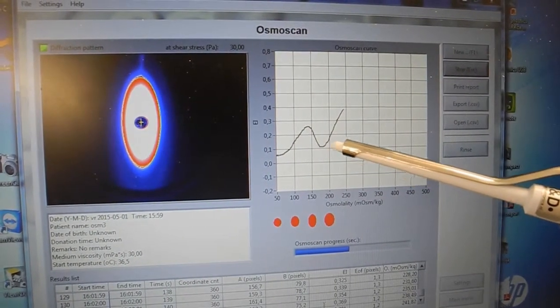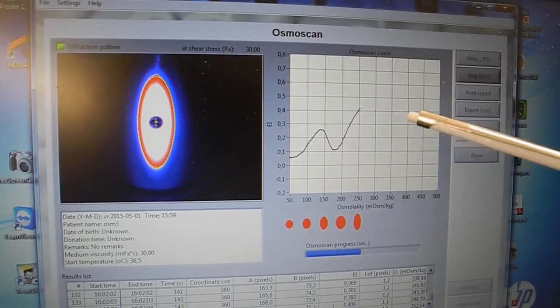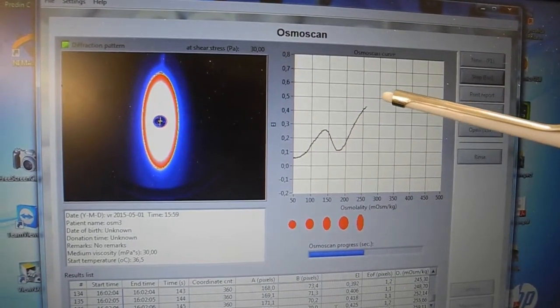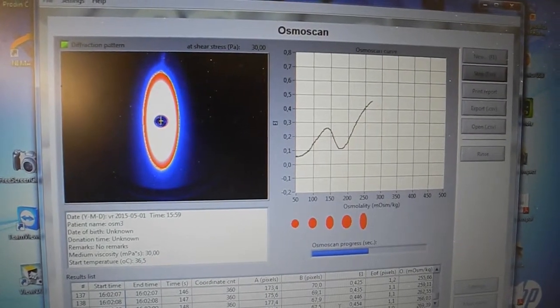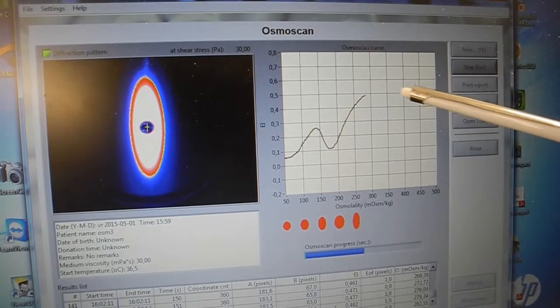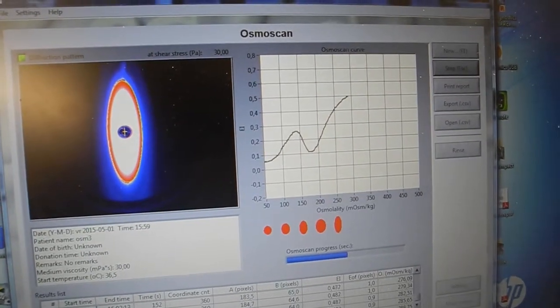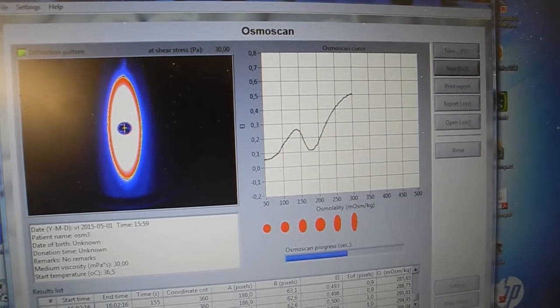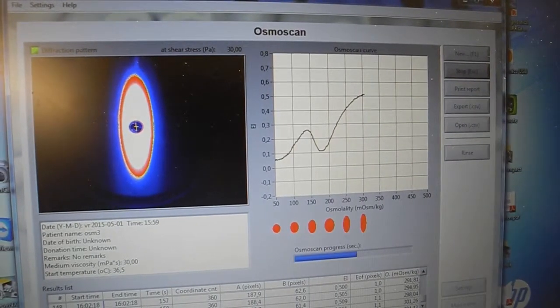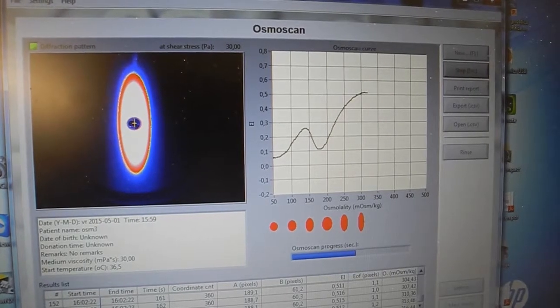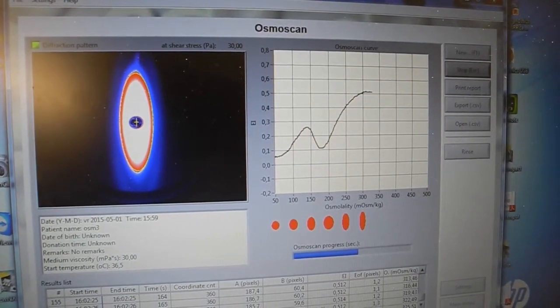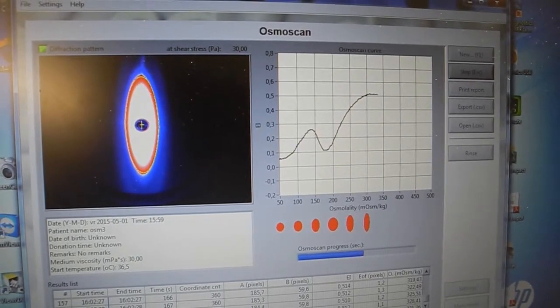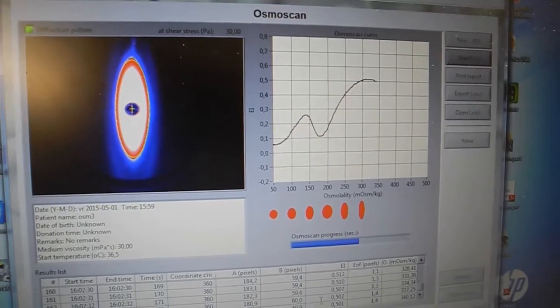They start getting more and more elastic as they approach the optimal osmolality for the cells, which should be around 300. It will go down after 300 where the cells will shrink, shrinking like a raisin that gets rigid from being shrunk.